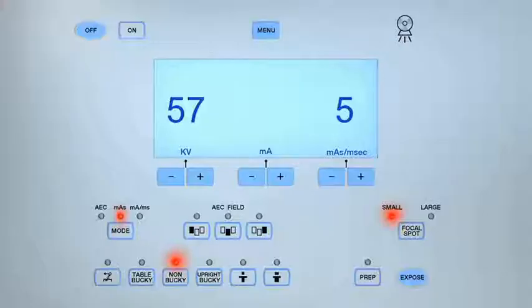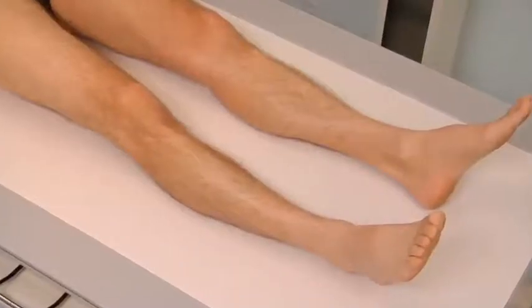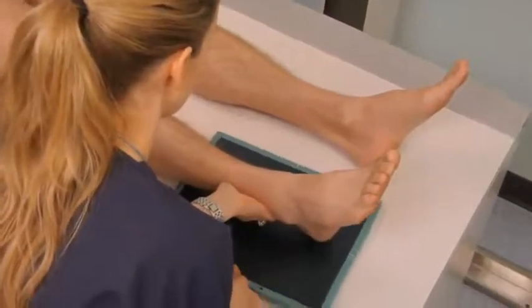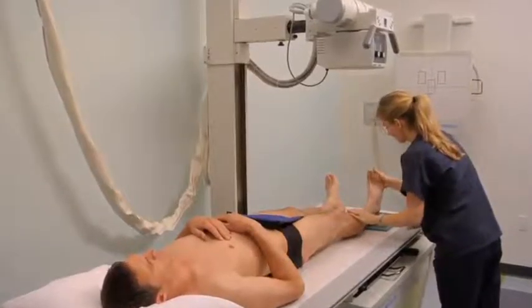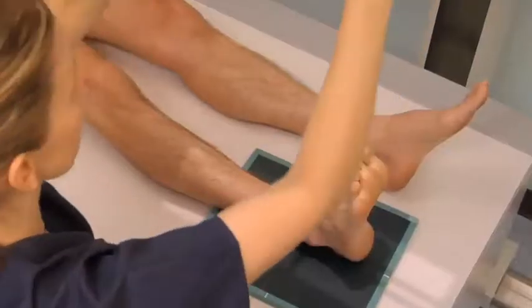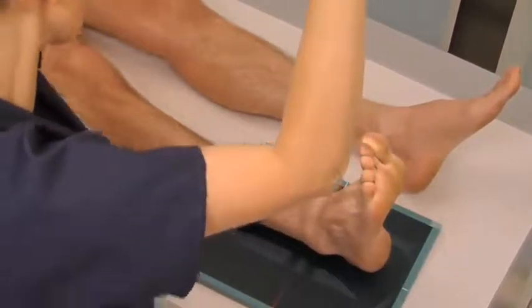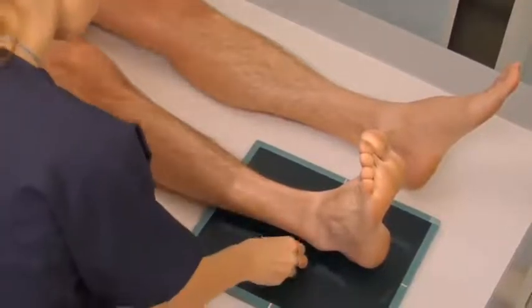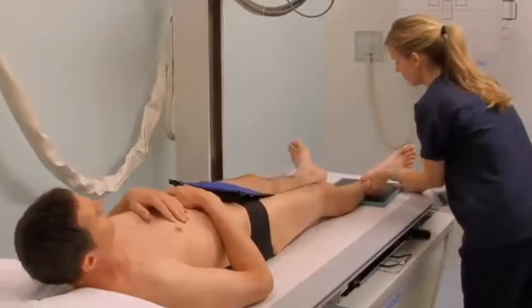For an AP angle projection of the ankle, set the KV to between 55 and 60. Position the patient supine with legs extended and separated slightly. Place an 8 by 10 inch cassette lengthwise on the tabletop and align the ankle to the center of the cassette. Allow the foot to remain in a natural position, only slightly dorsiflexed or not at all. Align the central ray perpendicular to the midpoint between the malleoli. Collimate to include the distal tibia and fibula, lateral and medial malleoli, proximal metatarsals, and soft tissue structures. Place the appropriate lead marker, expose the cassette, and proceed to the next projection.